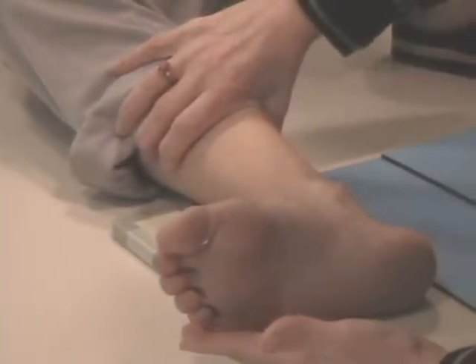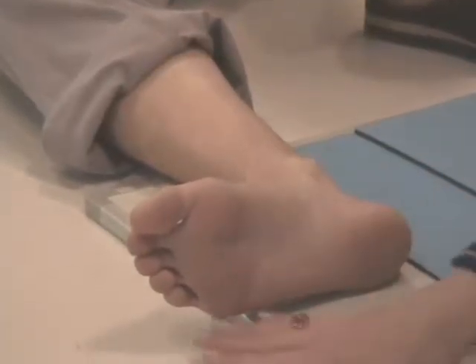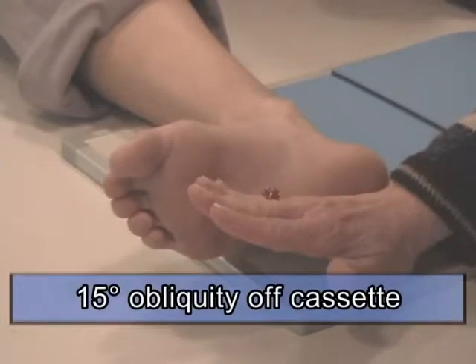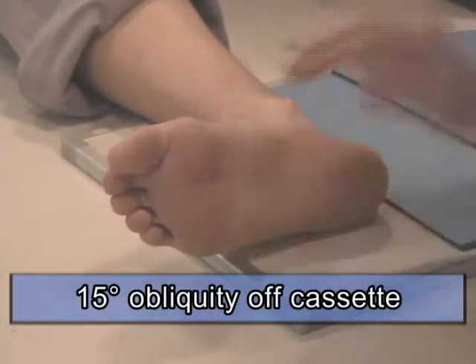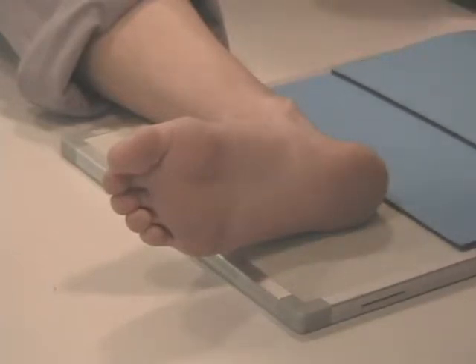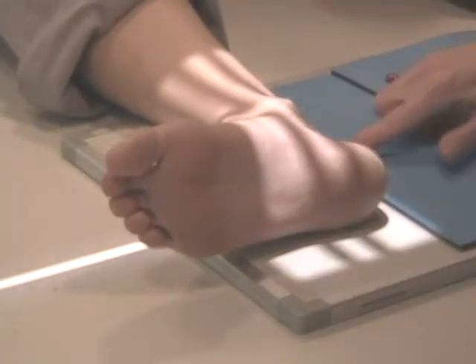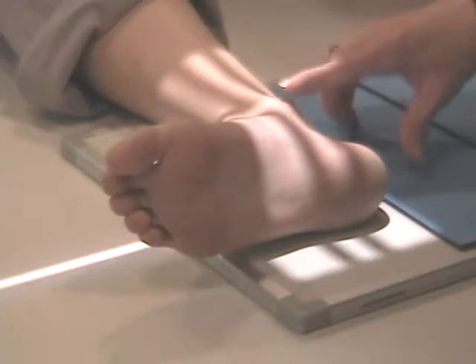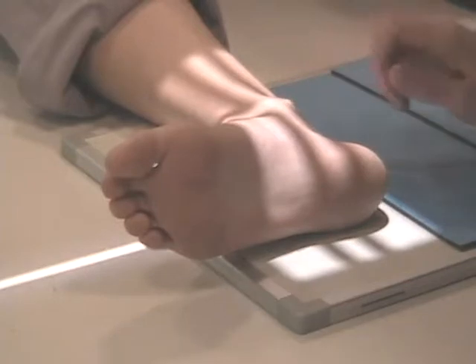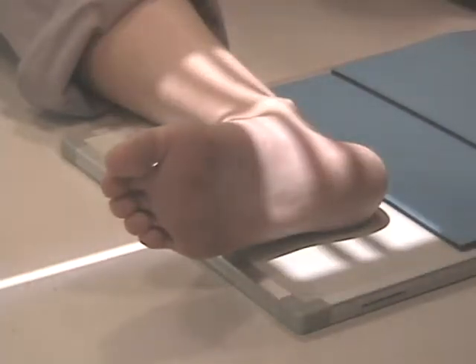And notice how the foot is slightly up off the cassette. I can stick my fingers in there, and that means I have about a 15-degree obliquity off of the cassette. That has my malleoli superimposed, one right on top of the other. And I'll check my centering now again. Baby light. Central ray coming down the joint space, as evidenced by the tibial malleoli, and a little bit of collimation there. Leg is straight, and that's my third exposure of the ankle.